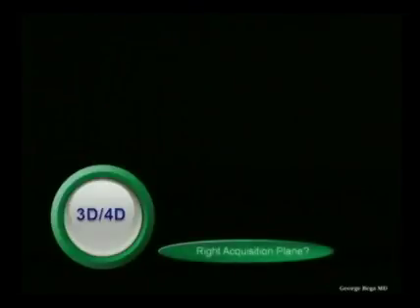Now, important to understand here is that there is a confusion that new users of 3D ultrasound expect to just find where that 3D, 4D button is on the machine, and somehow the diagnosis might be on the screen right after. The fact of the matter is, this is a lot of information that would need to be acquired, and this information needs to be processed. There are many pre and post steps in order to acquire a diagnostic, clinically useful 3D ultrasound. It has to do a lot with knowing the right optimization.